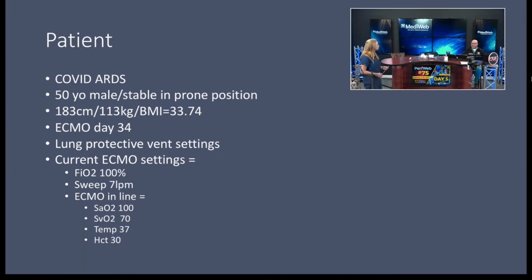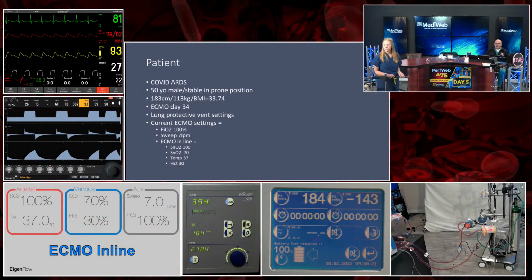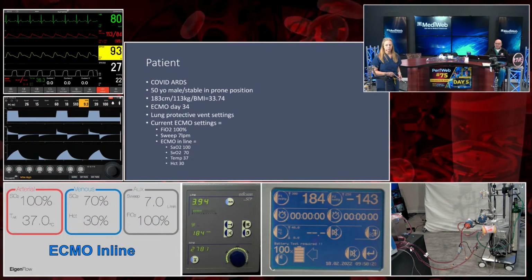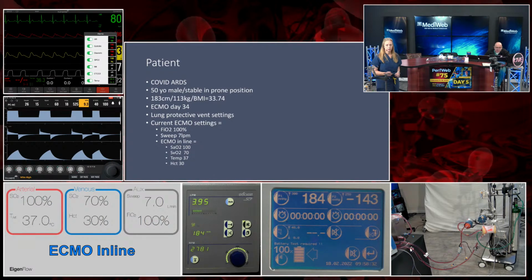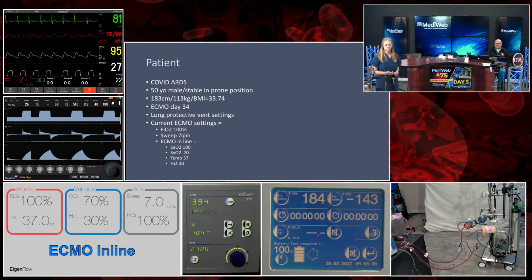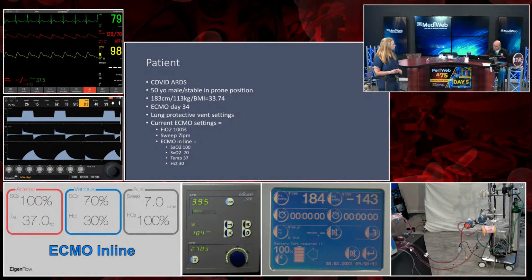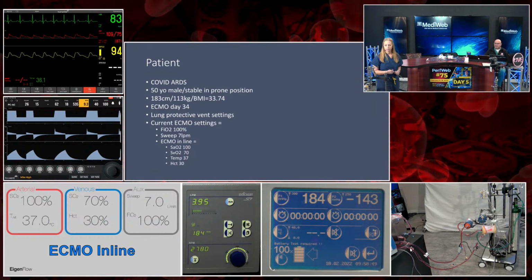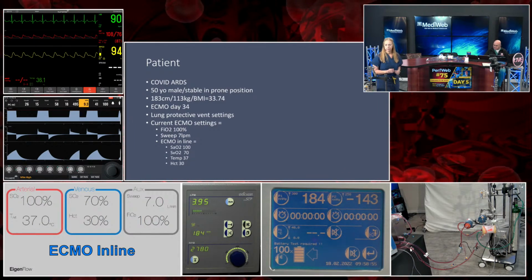Okay, so let's go ahead and start, bring on all the sounds, and we're going to get the patient ready for making this change from the prone position back to supine. Okay, and I'm going to go ahead and push the button. Tammy, are you ready? I'm ready. All right, let's go ahead and get this done. So we're in there with the nurses, we're assisting, and we get the patient flipped over.